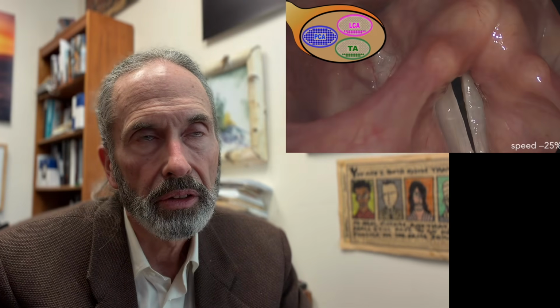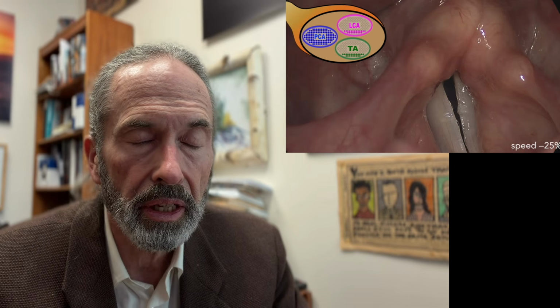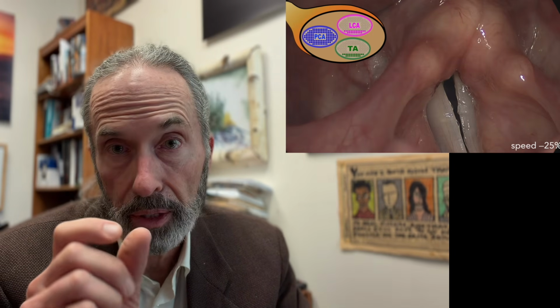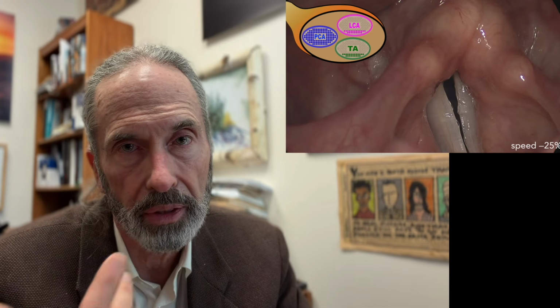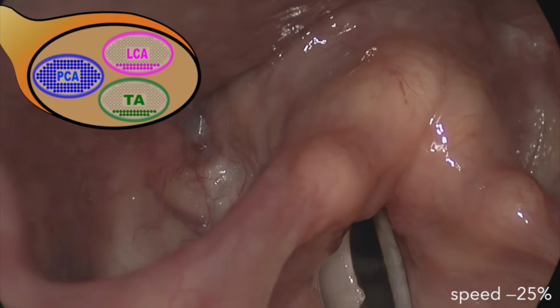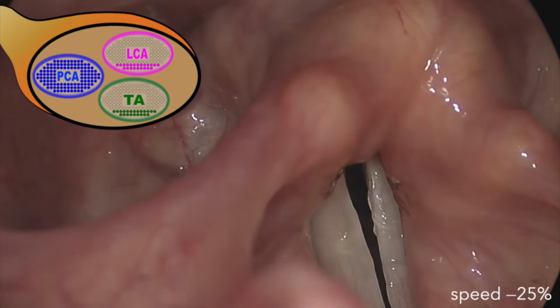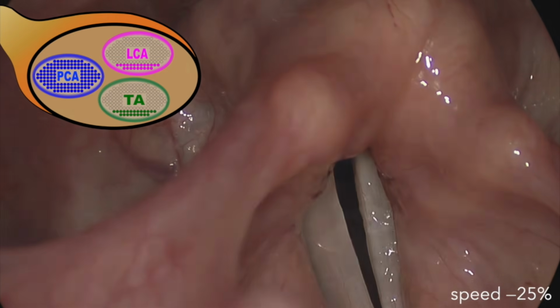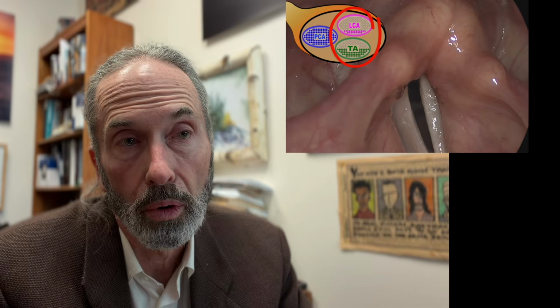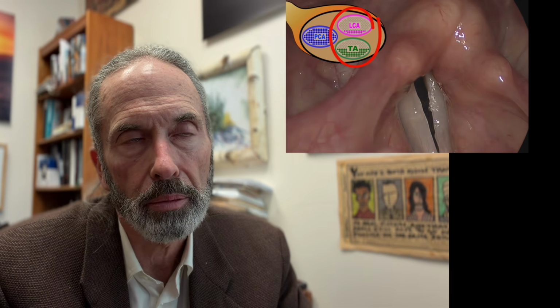that this on the right side is probably some injury that includes both anterior branches of the recurrent nerve, and they're quite closely related to each other, so it's very easy to injure both of these branches. It seems like there's a minor weakness of the thyroarytenoid muscle. There's a more major weakness of the right lateral cricoarytenoid muscle.